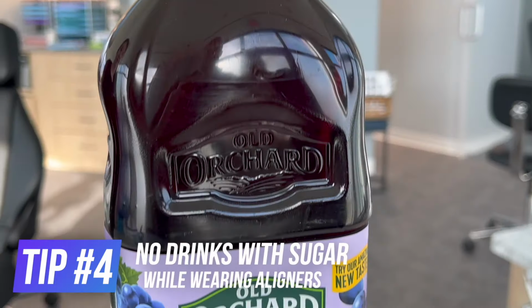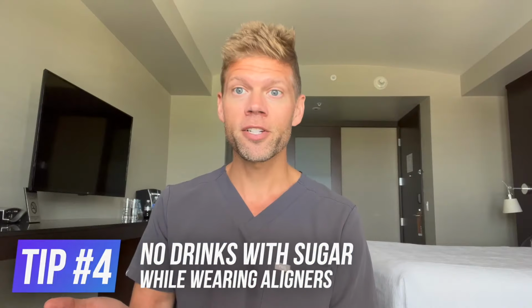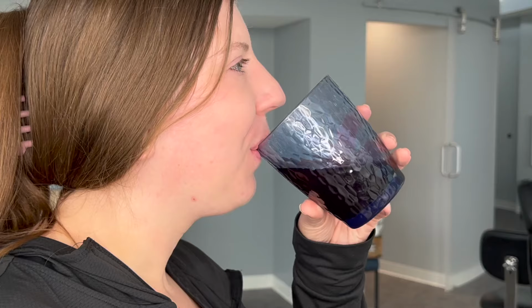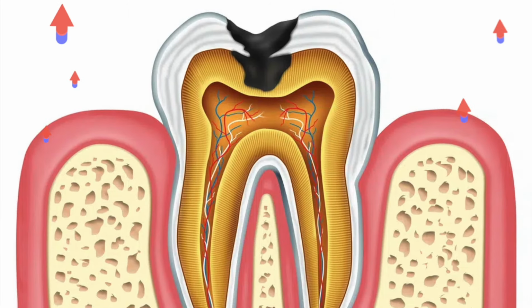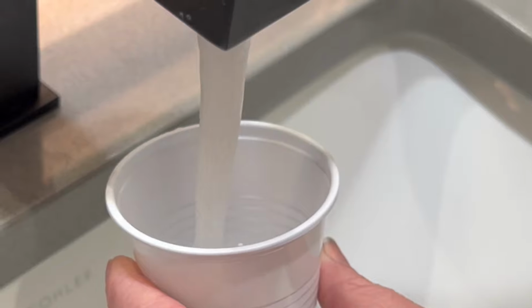Next, don't drink anything with sugar while you have your aligners in your mouth. The reason for this is because the sugar actually will get trapped underneath the aligners, and now that your tongue can't cleanse your teeth naturally because you have plastic over the tops of them, it will increase your risk for cavities. So anytime you drink anything with sugar in it, the aligners should be out, and you should wash your mouth out or give your teeth a quick brush before putting your aligners back in.